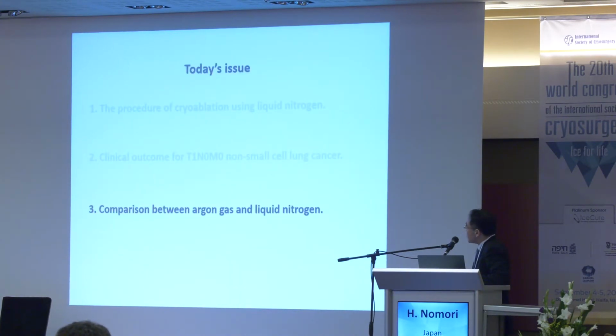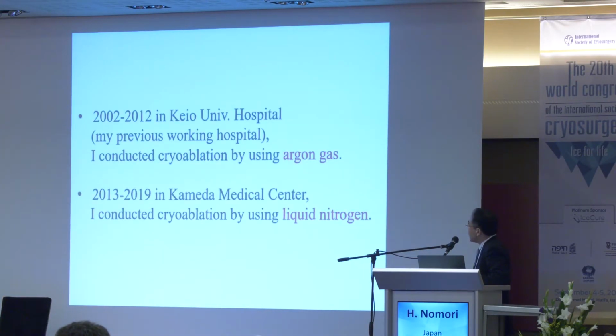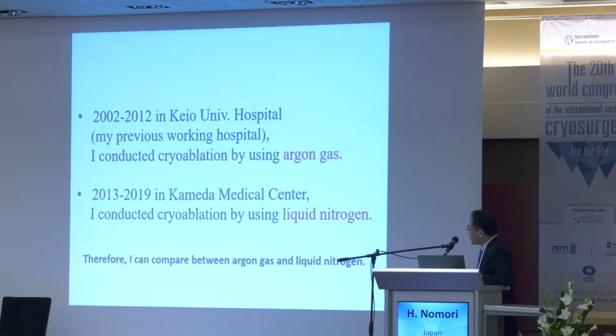And the last issue is a comparison between argon gas and liquid nitrogen. From 2002 to 2012 in Keio University Hospital, my previous working hospital, I conducted cryoablation by using argon gas. Between 2013 and 2019, in Kameda Medical Center, as I showed you now, I conducted cryoablation by using liquid nitrogen. Therefore, I can compare between the two.